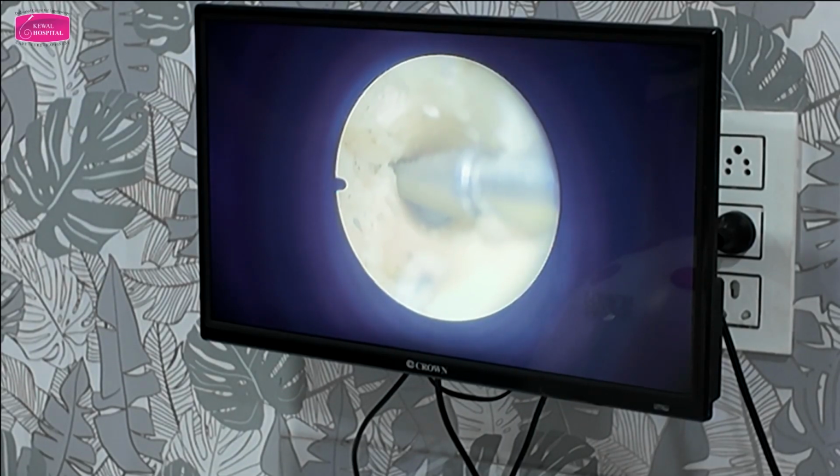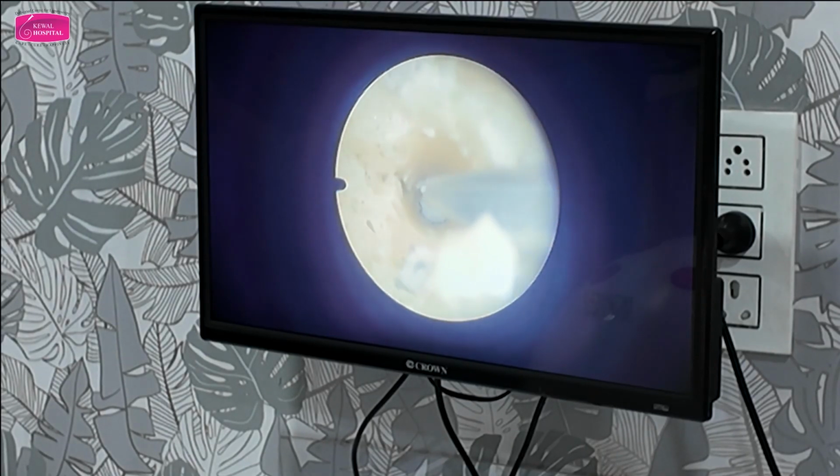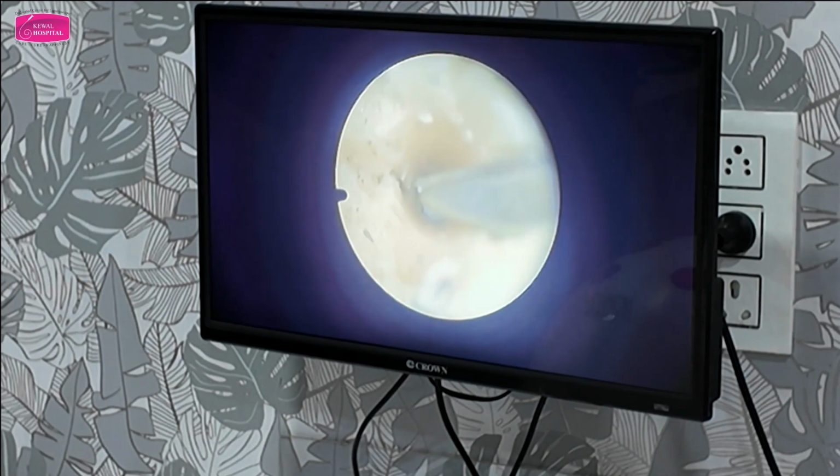You understood this? Correct? The cannulation wire will go like this. So you don't have to pass cannulation wire through and through. You just go and stay near the ostia and then push the fluid. With hydrodissection, it will go. Suppose there is any flimsy block, it will be cleared. Right? You understood about this?